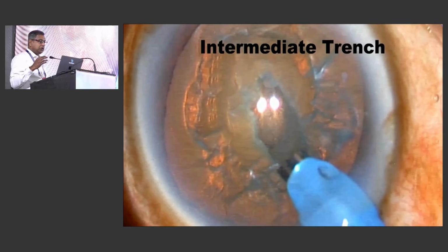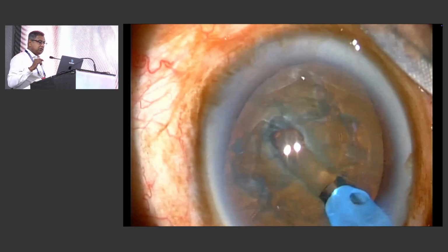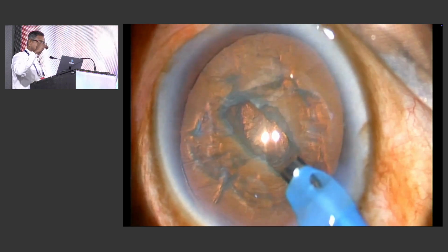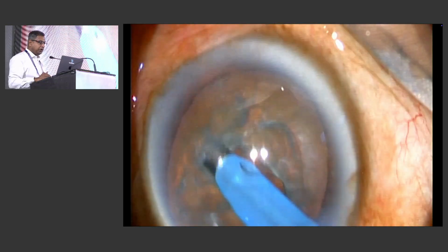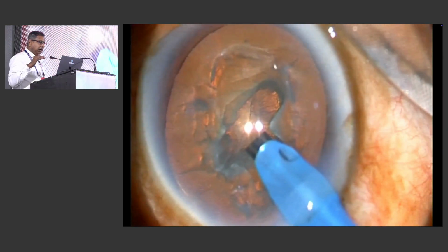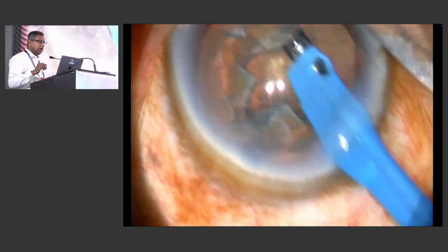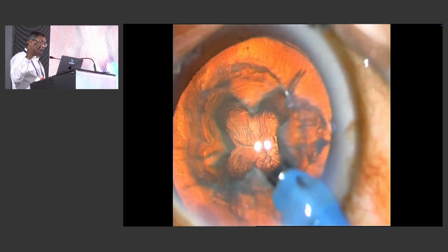If you want to do divide and conquer, which is the starting technique, you need to go deeper than that. But what I suggest is, instead of crossing the midline, you do it in two halves. Do your proximal subincisional groove up to the Purkinje images in the middle, rotate the nucleus 180 degrees, and complete the groove to your appropriate depth. Then a 90-degree rotation and go deeper, a 180-degree rotation again, and complete the cruciate trenches. Use good magnification and good fine focus for the depth of the floor.